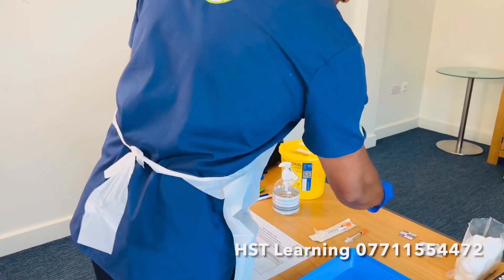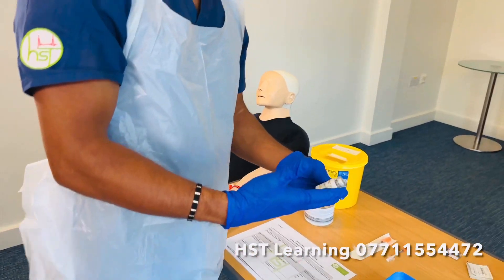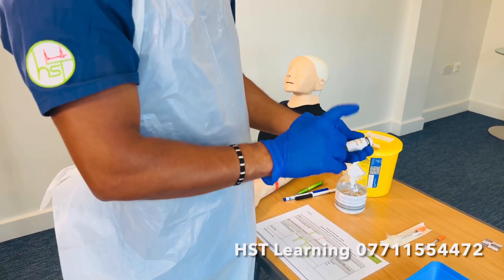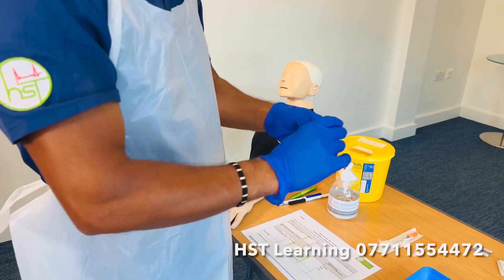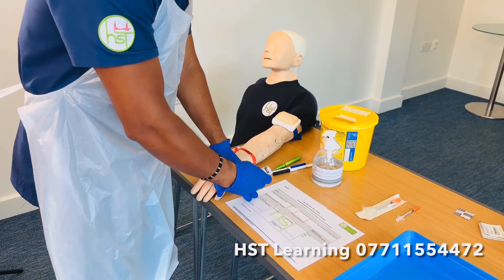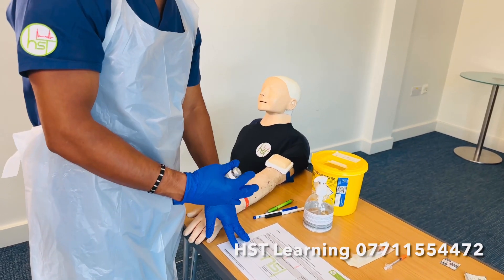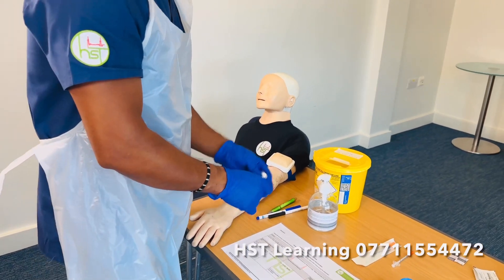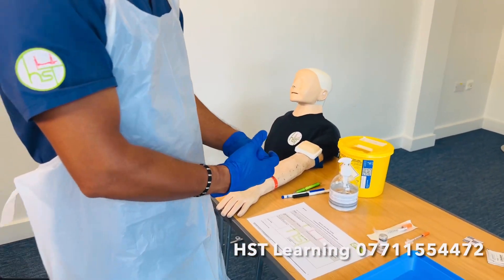Now I'm going to check the medication. A common error people make is not reading the medication name, dose, and expiry date. Make sure you read that out loudly and cross-check with the prescription whether the six rights of medication are met, and that the prescription is legible and valid — please read it out loudly and confirm that.